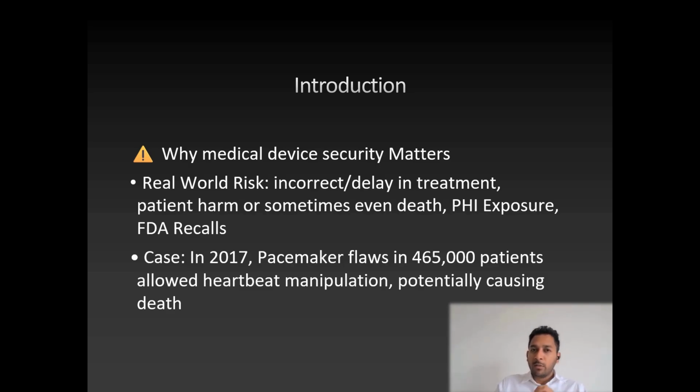But that wasn't even the main problem. The real challenge started after that. Since this device is implantable, it required invasive surgery to get the device out and update the firmware. Some people couldn't even have survived. So even applying a fix is not as straightforward.